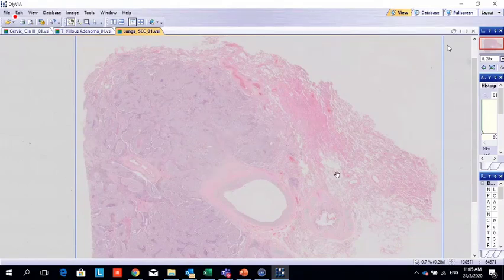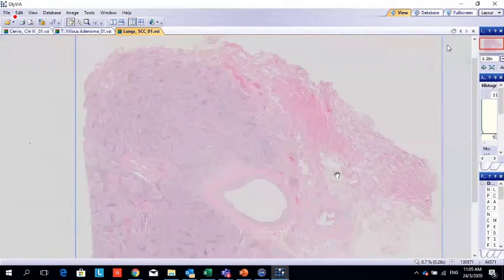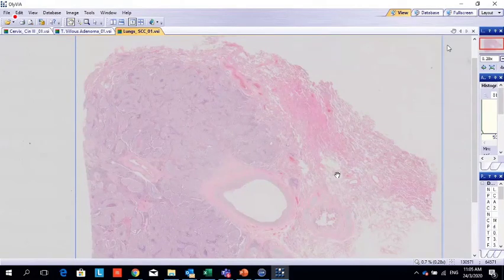Okay, if we see a mass in the apex of the lung, what do you think? In this case, we think not only the tumor, because TB can also give an X-ray as a mass in the apex.